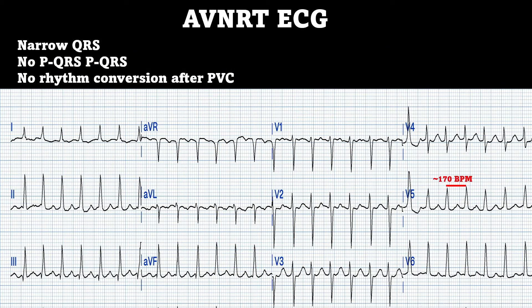This is our 12 lead of an AVNRT. I see regular narrow complex tachycardia with no P-waves. The rate is around 160 to 170 beats per minute, which is probably a bit too fast for sinus tachycardia. This helps drop down our differentials to AVRT, AVNRT, and atrial flutter. The PVC is kind of key here — there aren't any flutter waves noted after the PVC, so flutter is kind of out. You can see our PVC in V4 and V5. The rhythm also did not convert after the PVC, so this takes out AVRT and leaves our AV nodal re-entry tachycardia.